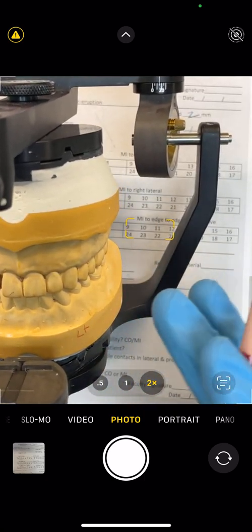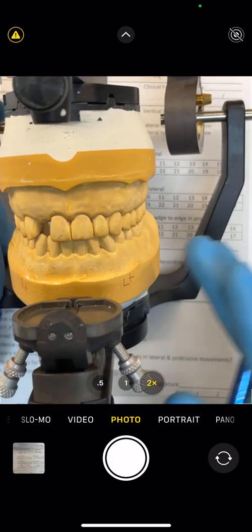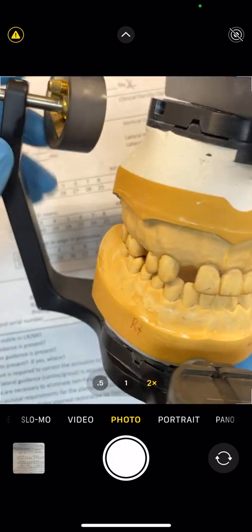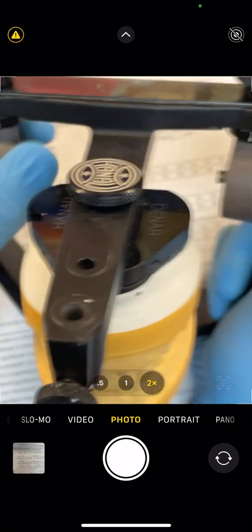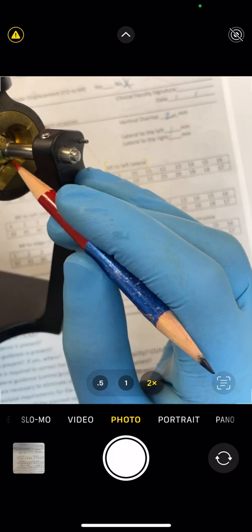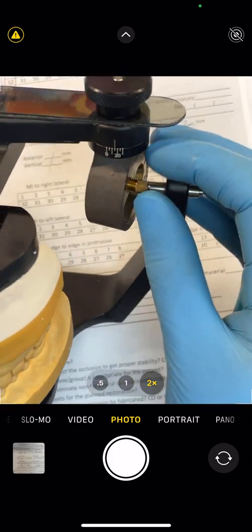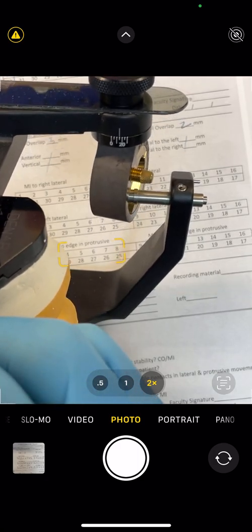We are going to start with working movement on the left side. To do that, you have to loosen the centric knobs or centric locks, so the condyles in the socket can move freely. Once you free them, this is moving good.